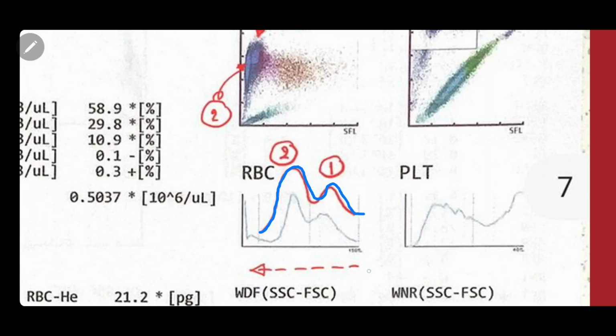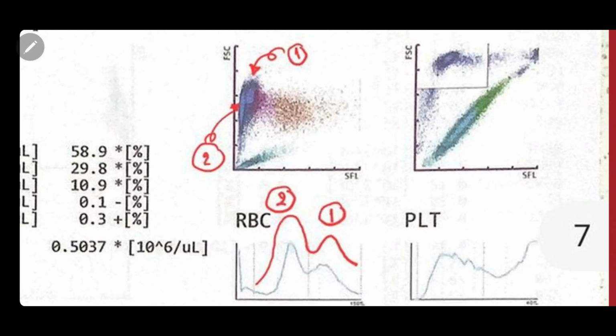When reading the graph, we read from right to left. So new cells will appear from the right and move to the left. This indicates that there are new iron supplies and old iron in red blood cells that are not uniform in quantity. If you can read the graph well, you will clearly see that there are two distinct groups in this section. It's essentially the same thing.